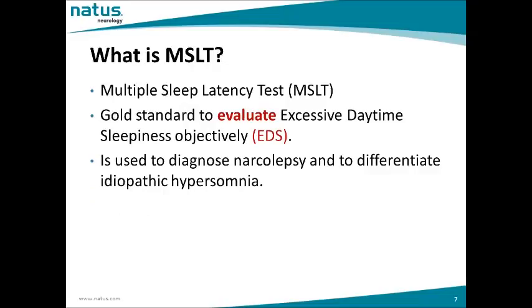Okay, let's start off here. What is MSLT? MSLT stands for Multiple Sleep Latency Test. It is a gold standard to evaluate excessive daytime sleepiness objectively. MSLT is also used to diagnose narcolepsy and to differentiate idiopathic hypersomnia.